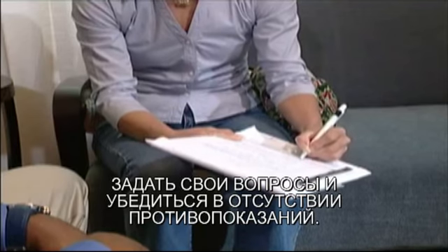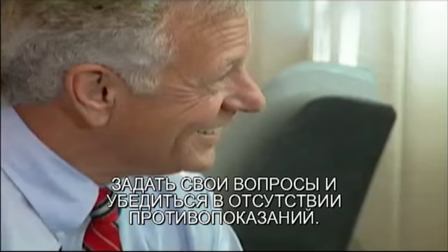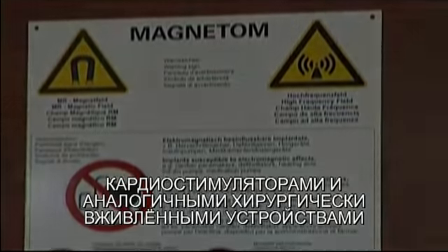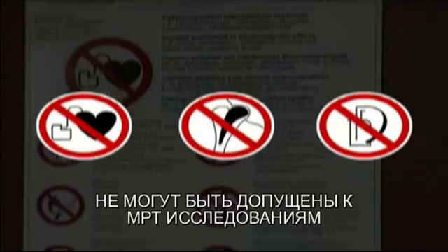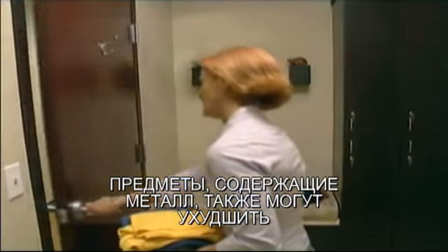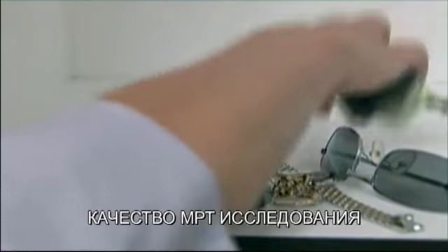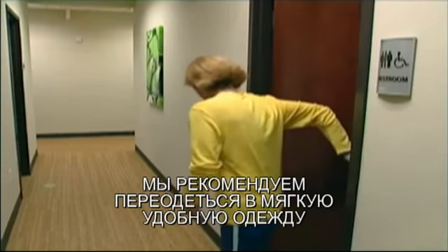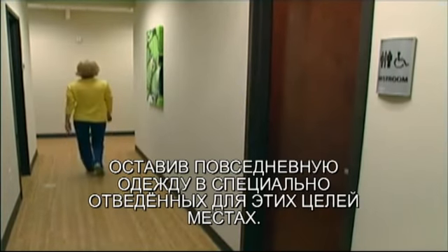At this time, you may be asked some questions to make sure that you are eligible to undergo the MRI examination. For instance, patients with metallic foreign bodies or surgically implanted devices like cardiac pacemakers and aneurysm clips are not eligible. These devices may be adversely affected by the magnetic field. Objects containing ferrous metals will also interfere with obtaining a good MR image. Therefore, it's advisable to wear a sweatsuit, clothes without zippers, snaps, or buckles, or garments provided by the imaging facility.